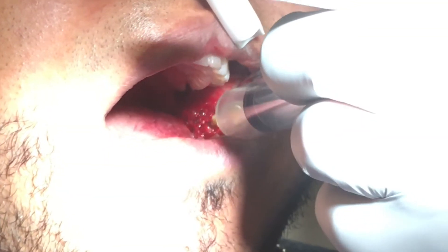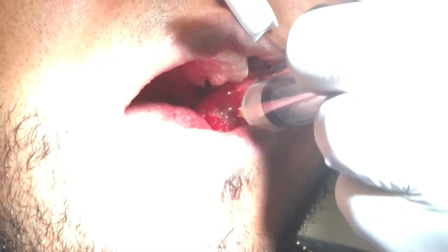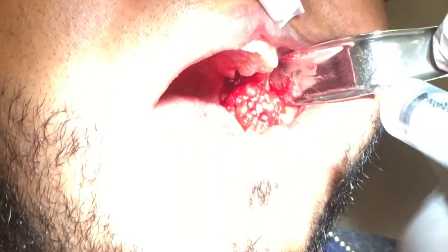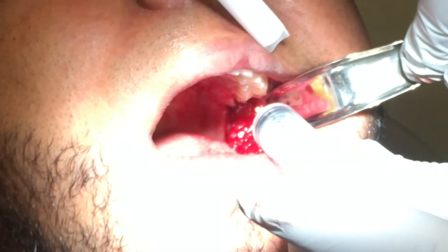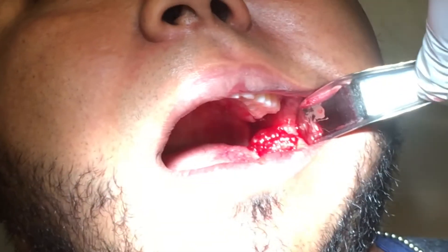It can make people feel like they want to cough a little bit. We've got an upper extraction site — upper teeth that we've taken out. This site isn't that dirty.